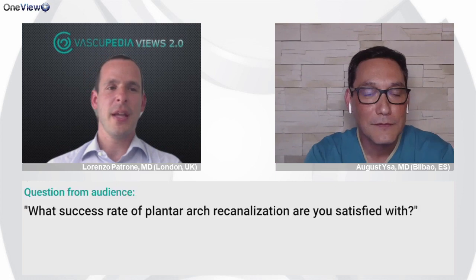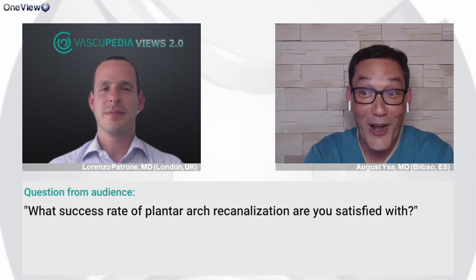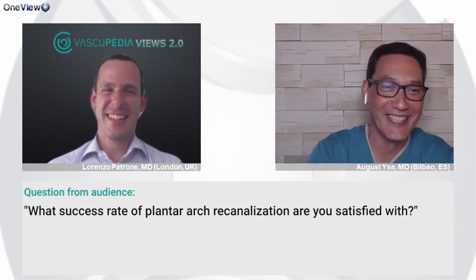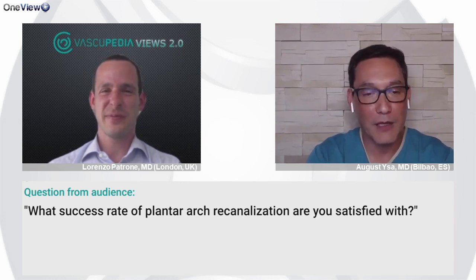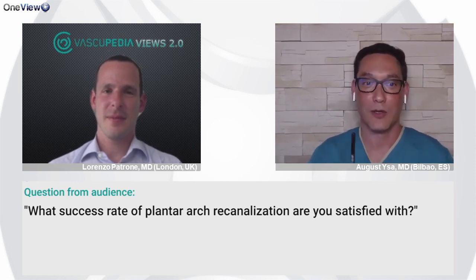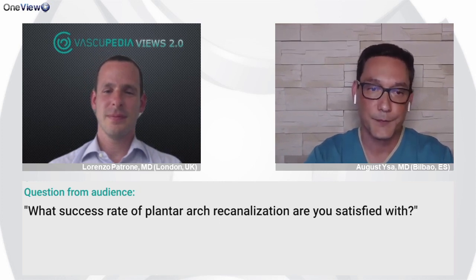So another question is from Javier. What success rate of plantar arch recanalization are you satisfied with? Good question. Javier is a friend of mine, which is not really a friendly question. People have mentioned even revascularization like 60%. It's amazing to see that people from Japan in the Rendezvous trial reported like 85% success rate, but they are the top guns, people like Kawasaki, Nakama. I would say 60% is fair enough.